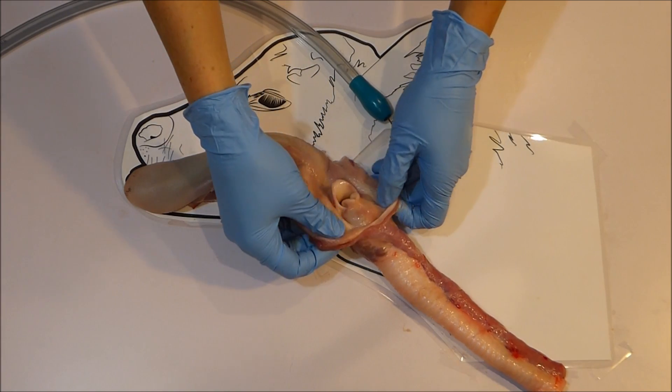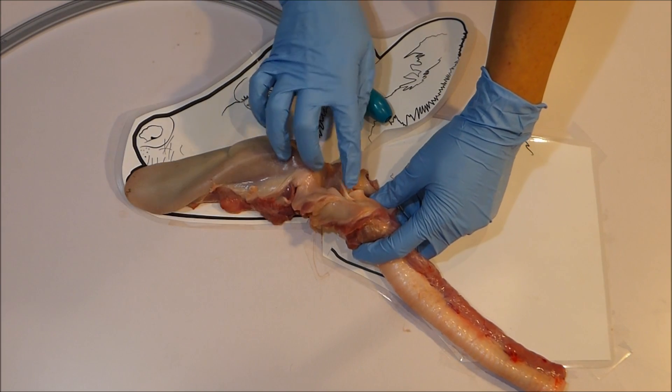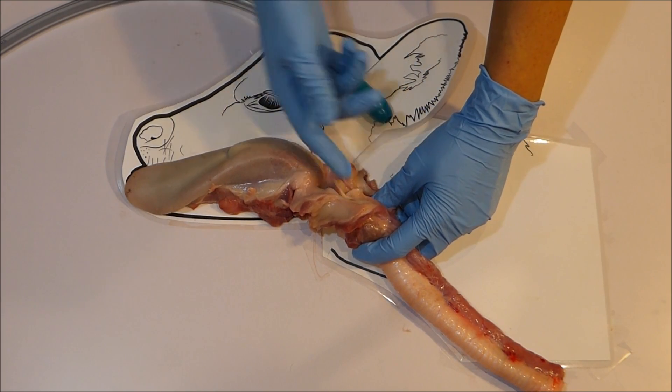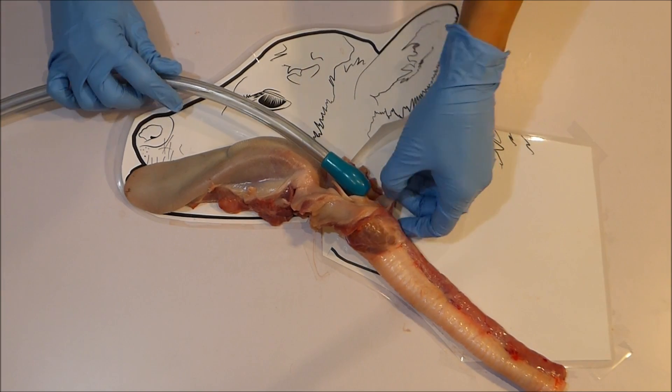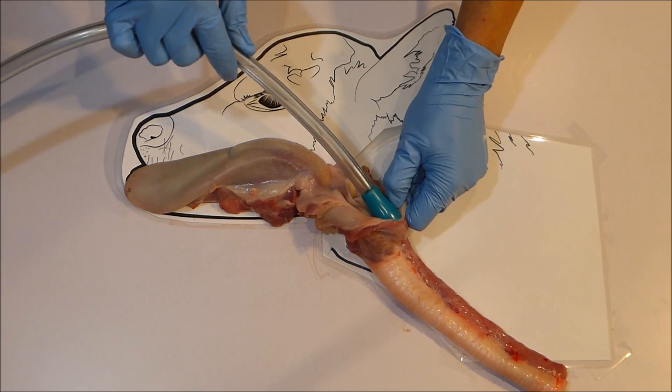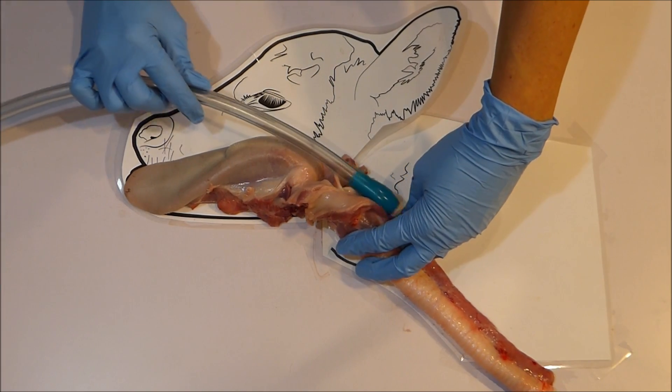With the top of the throat open like this you can see that the airway entrance is quite vertical rather than horizontal. This is another reason why it is much easier to pass the tube into the esophagus than it is to pass the tube into the airway.